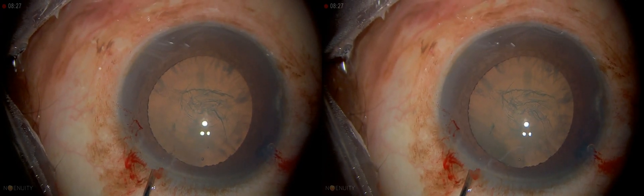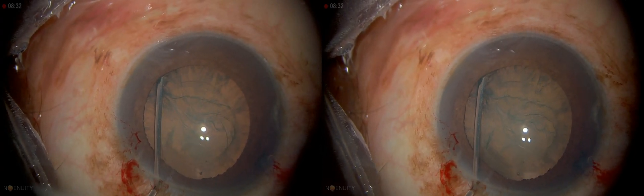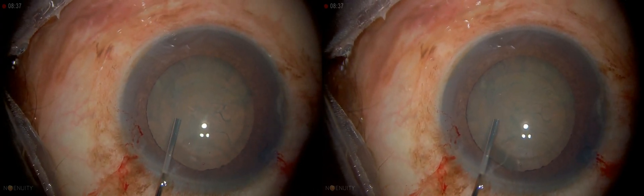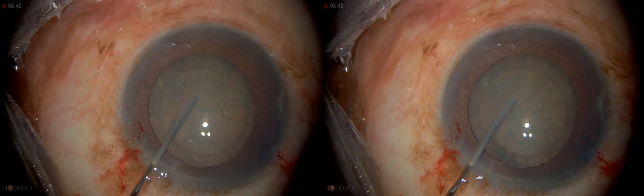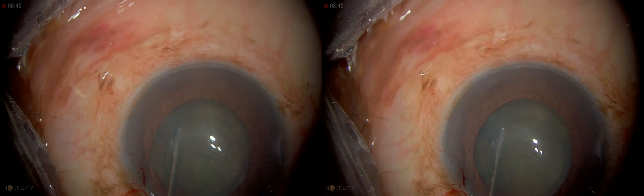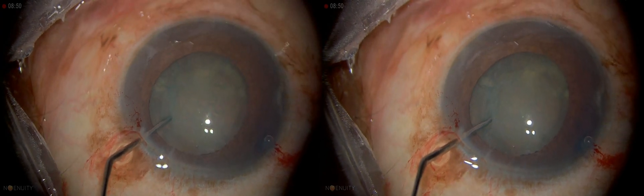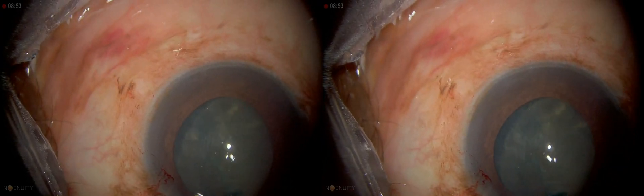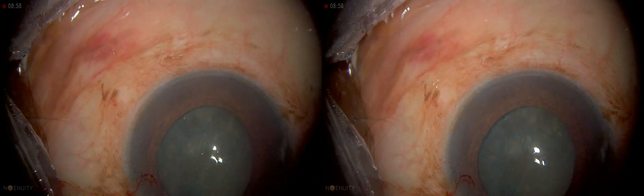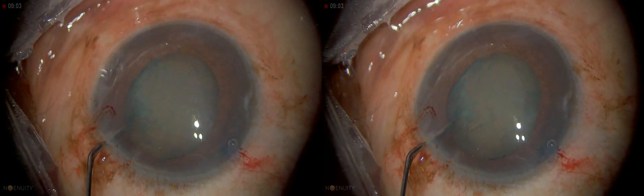When we go to the hydrodissection, you want to lift up on the capsule — go in, lift up, push hard. The lens is now pushing up against the capsule. I want to decompress it, so I decompress it at the edge. It just decompressed. Now we want to rotate the lens and make sure it spins. Didn't spin so easy. I'm going to try again — nope. So then I switch direction. There it goes. Now it's rotating.